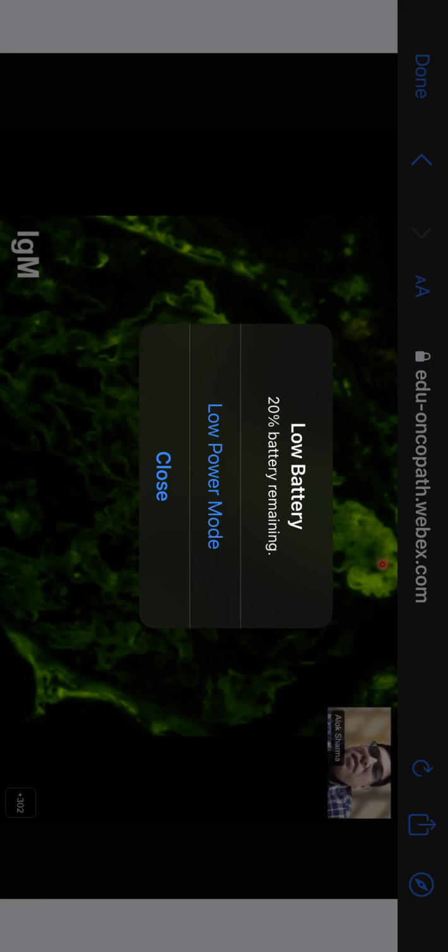So this is an area where the sclerosis is occurring, right? It's not an immune deposit, it's just an entrapment of the IgM, but it gives you an idea. So sometimes what happens, you don't have an FSGS in the LM core. Remember, there are different cores. And if you pick this finding in the IF core, you can make a diagnosis of FSGS even on the IF core. So that is the idea of putting this slide here. And we do it more often than not in routine practice.